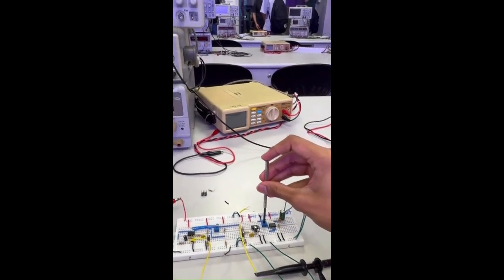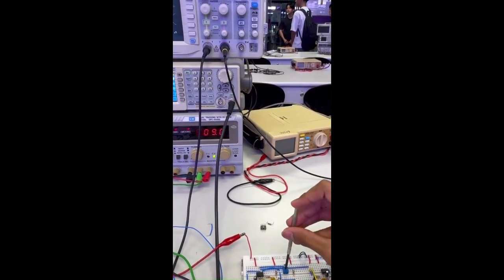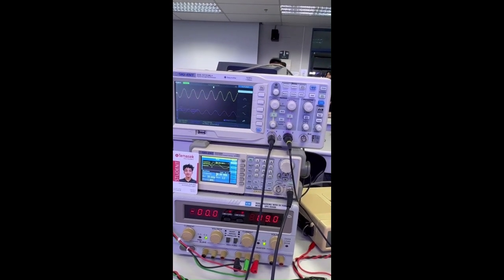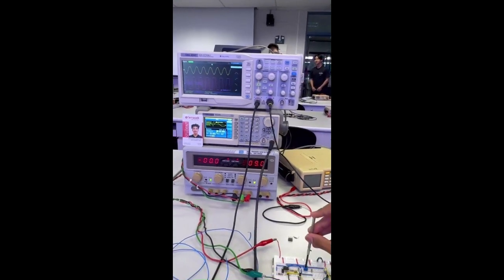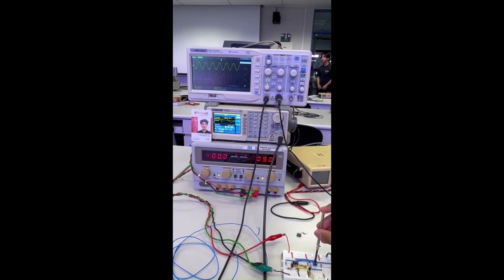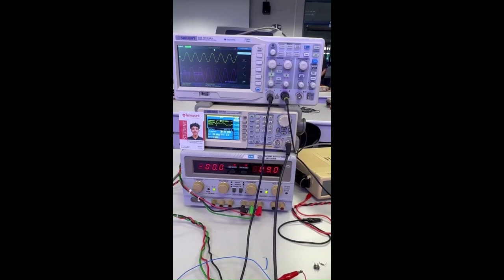This is me adjusting the trimmer potentiometer. And as you can see, at its max resistance, the waveform is clipped. So I had to adjust it so that the waveform is shown clearly and not clipped like earlier on.